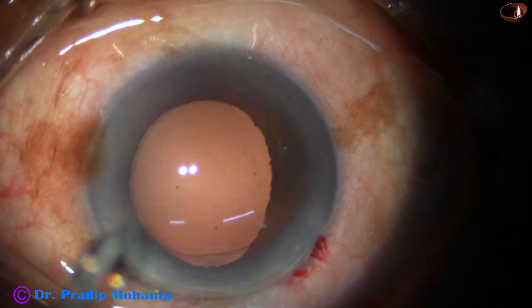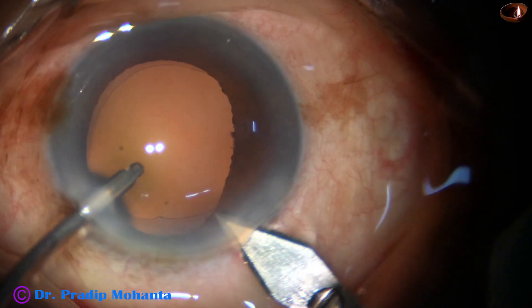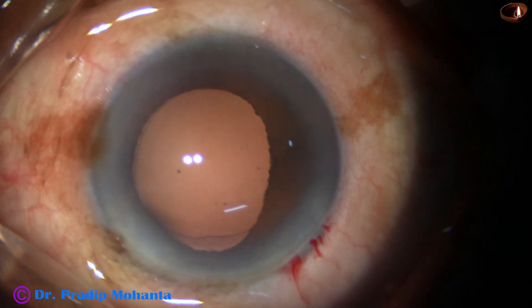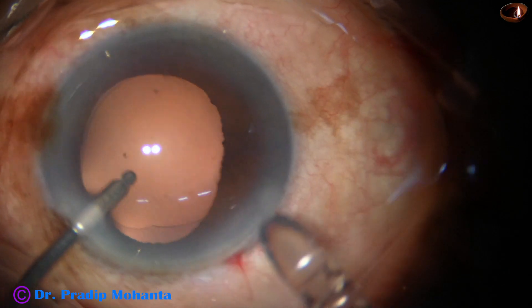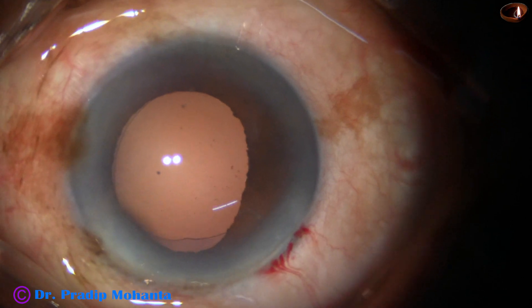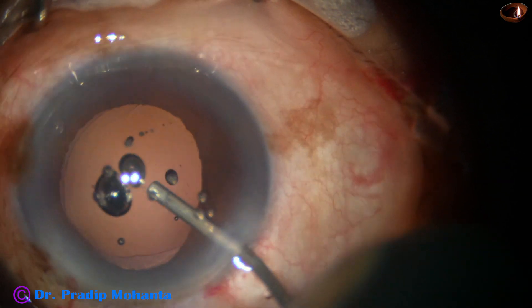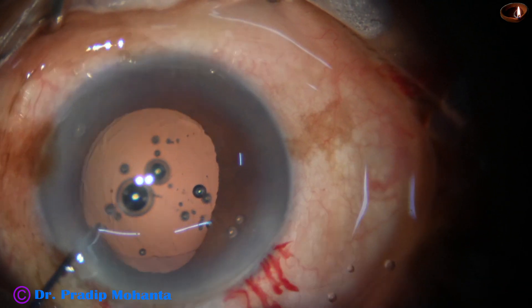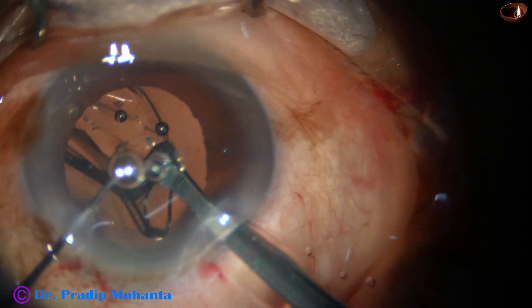By this time the cortex has been cleaned with the Simcoe cannula — a very safe instrument. Now I am enlarging the main wound because I am going to use a B cartridge. Hydroimplantation may be dangerous because the zonule is weak; suddenly there can be a zonular tear by the haptic. In such cases it is better to fill up the bag with viscoelastic and implant the lens under visco.